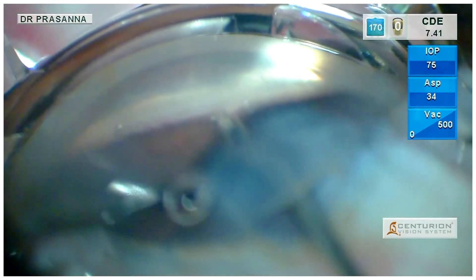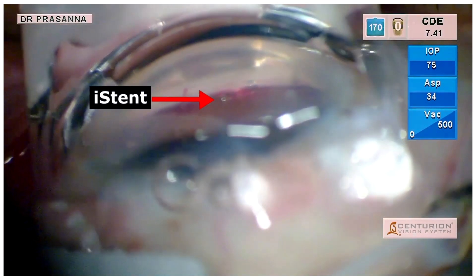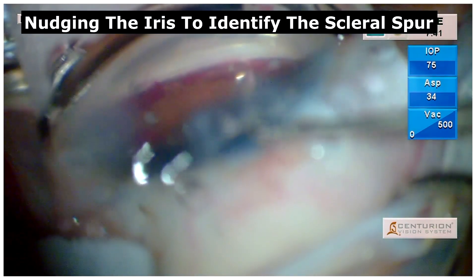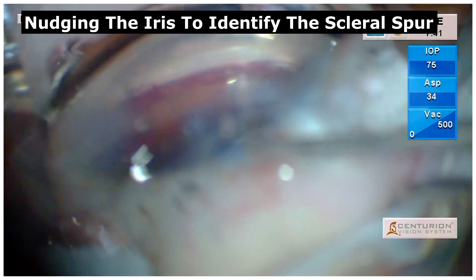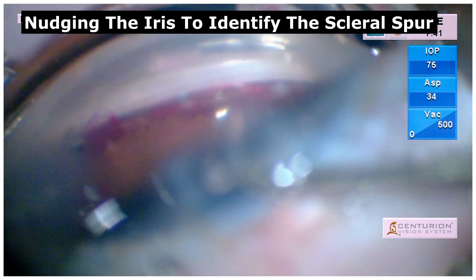Following which, we are not able to identify the positioning of the iStent within the trabecular meshwork as shown here. In such cases, with slow and controlled maneuvers with the dialer as shown here, the iris can be nudged gently to identify the scleral spur and confirm the position of the iStent within the trabecular meshwork.